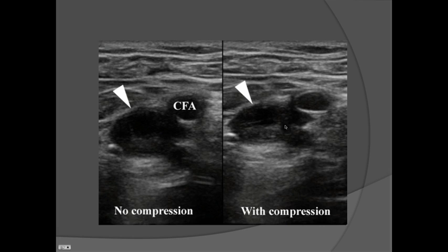Sometimes you'll see those clots and sometimes you won't. It depends on the state of that thrombus. Older clots will become more hyperechoic as the clot ages.